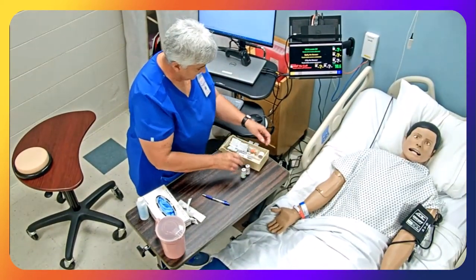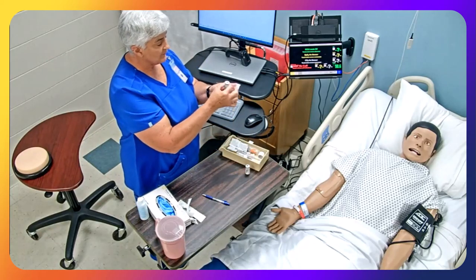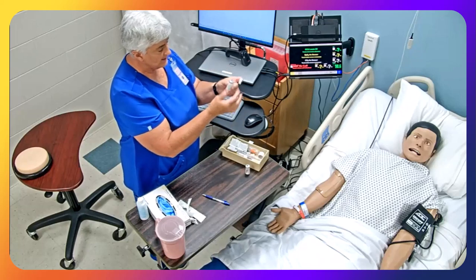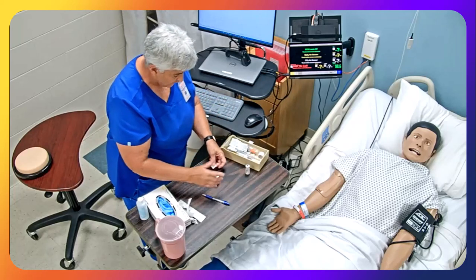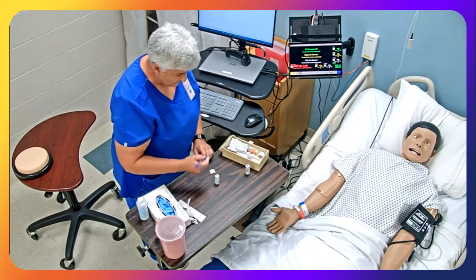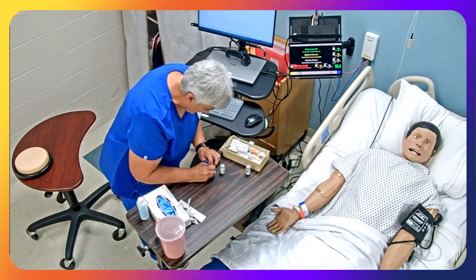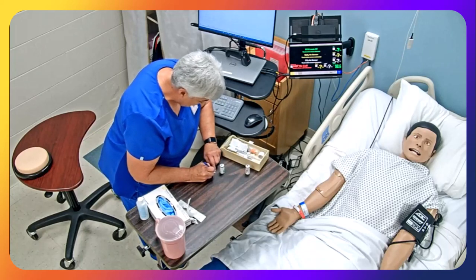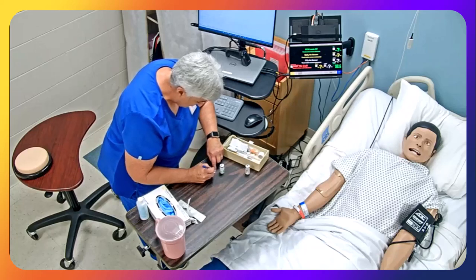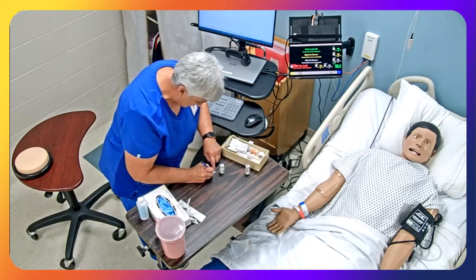Before I finish here, because insulin, we've got an expiration for the vial, but once it's open, then it needs to be date timed and initialed, because according to the hospital policy and procedure, most of the time this is only good once you've opened it for 30 days. So I'm going to put the date and the time and my initials.